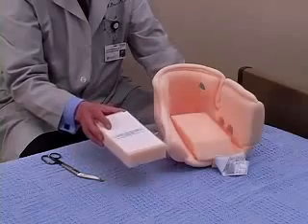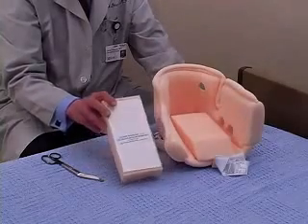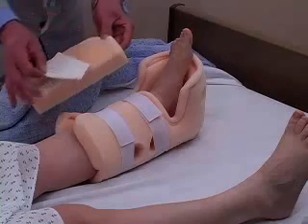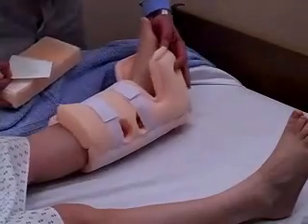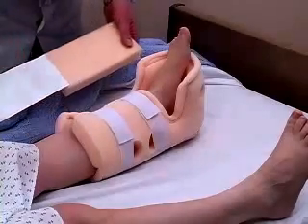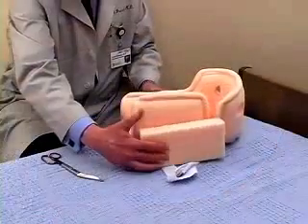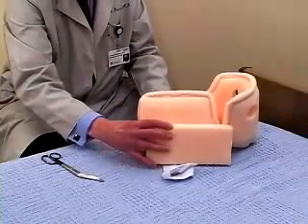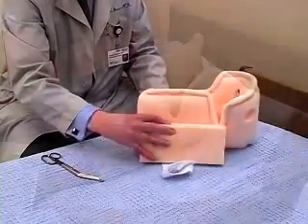Each boot comes with a spare pad. Note the message on the pad: "Do not throw me away, you might need me someday." The spare pad can be utilized in a number of ways. If there is a problem with external rotation, simply remove the protective adhesive paper and affix the spare pad to the side of the boot. This effectively eliminates the possibility of hip rotation.